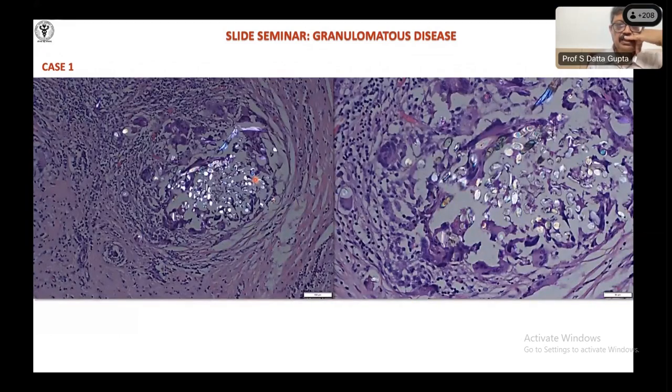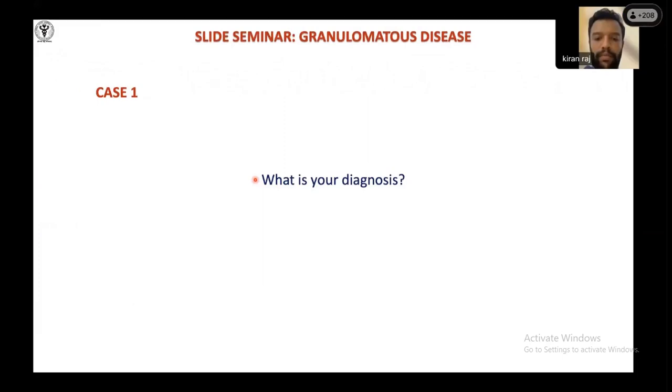Good. And this is polarizable material. Yes, sir. So what is that foreign body? Foreign body, yeah. Okay. Probably talc.